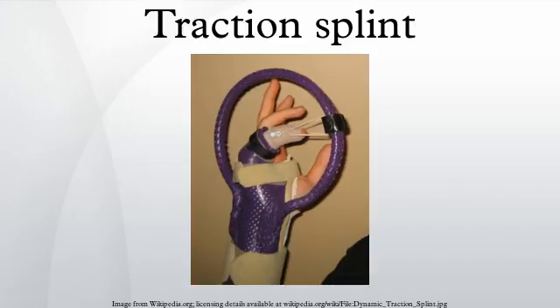A traction splint most commonly refers to a splinting device that uses straps attaching over the pelvis or hip as an anchor, a metal rod, to mimic normal bone stability and limb length, and a mechanical device to apply traction to the limb. A traction splint is commonly used to treat complete long bone fractures of the leg, femur and not for tibia and fibula area.